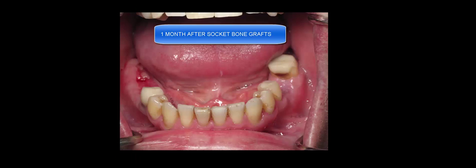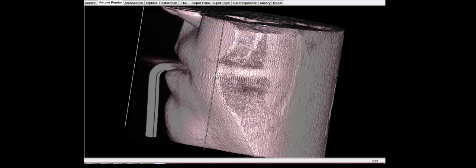And at the same time, a month later, you can see the socket bone actually healing very well.